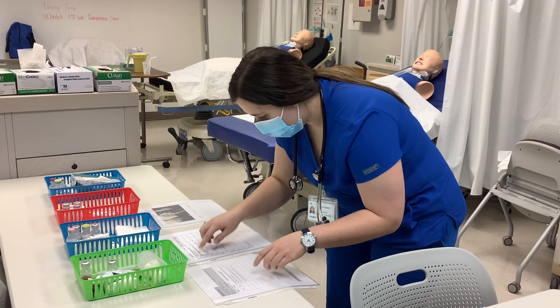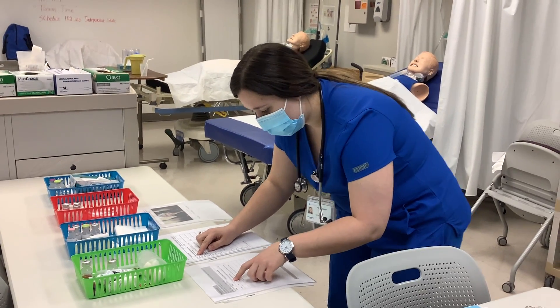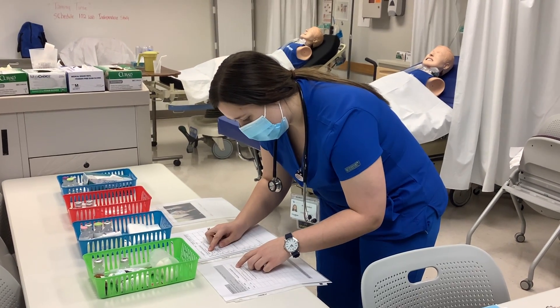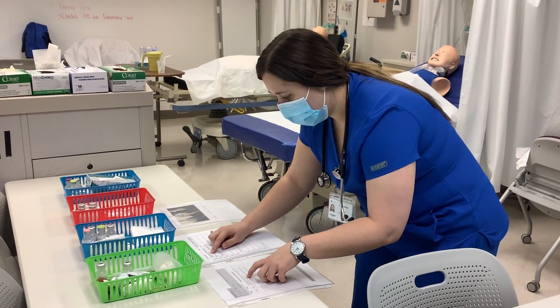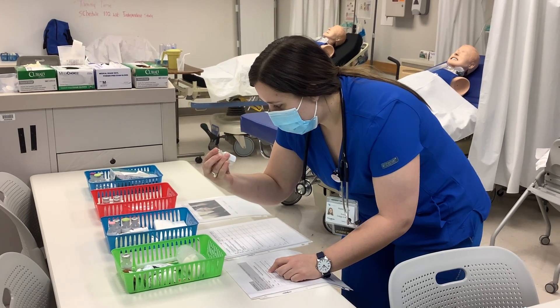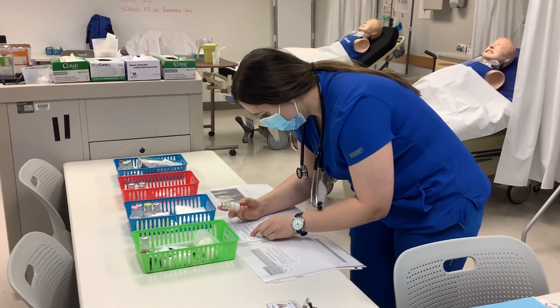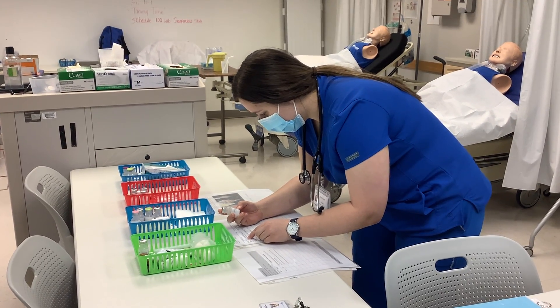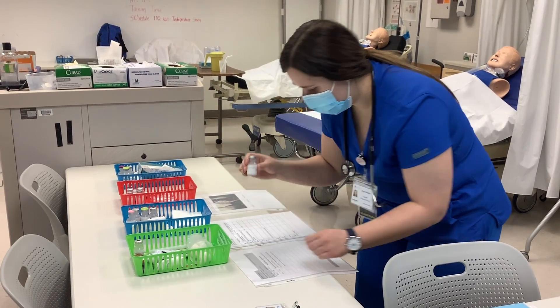We're going to be pulling from the Pyxis the Fluzone vaccine, 0.5 mL, intramuscular now, and we're going to get that in the deltoid site. Here is my Fluzone injection and it is unexpired — expires 12-30-2050. It is Fluzone 0.5 mL per dose.